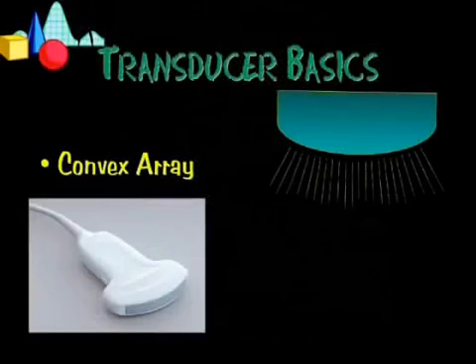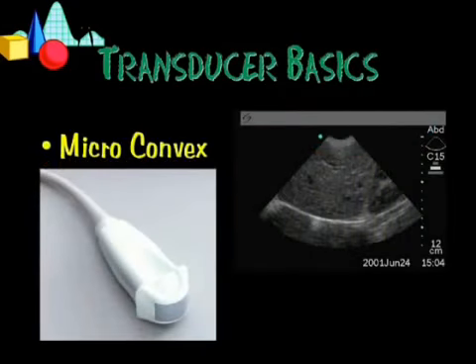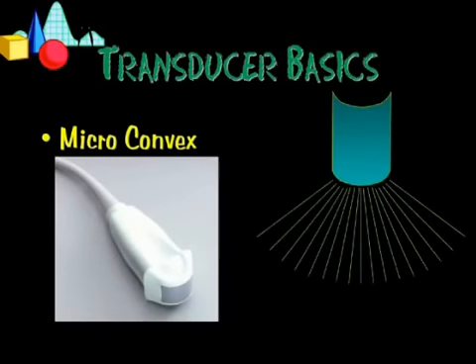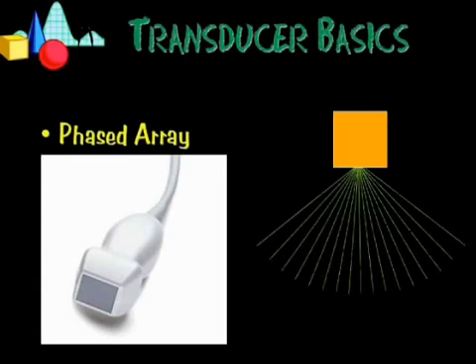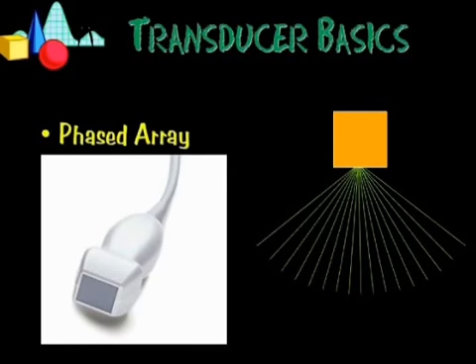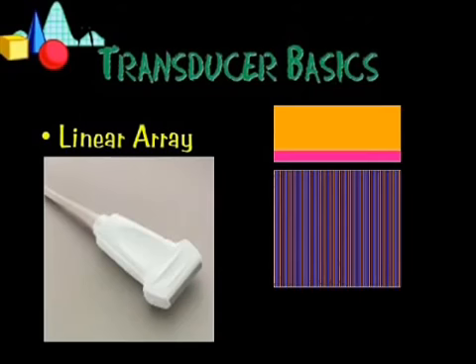The ultrasound machine is equipped with various types of probes. Convex probes and microconvex probes send out sound in a curved pattern, yielding a sector shape on the ultrasound machine screen. Phased array probes are flat, but steer their sound electronically, also producing a sector shape on the screen. Linear probes send out sound in a straight wave and produce a square shape at high resolution and high frequency.